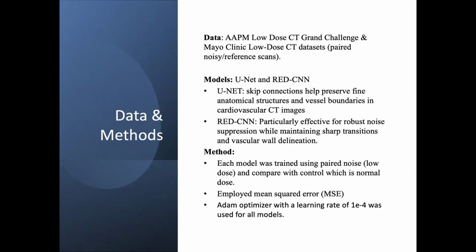So moving on to our data and method, the data I'm relying on is the AAPM Low Dose CT Grand Challenge. To achieve the result, I utilize two public datasets containing paired low-dose and normal-dose CT images from the AAPM Low Dose CT Grand Challenge and the Mayo Clinic.